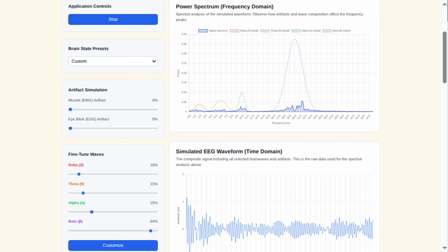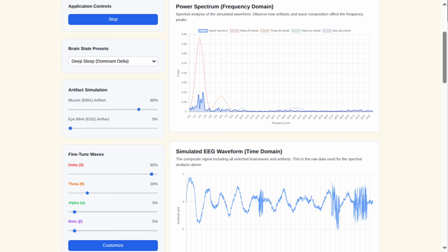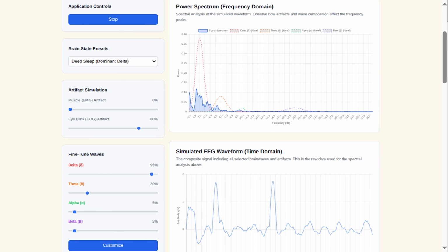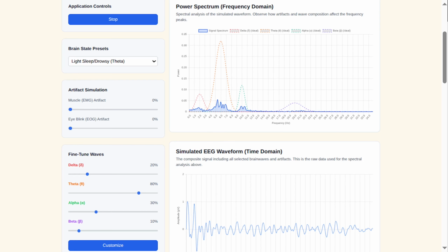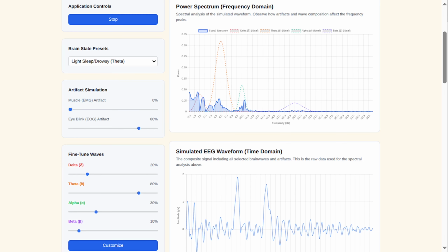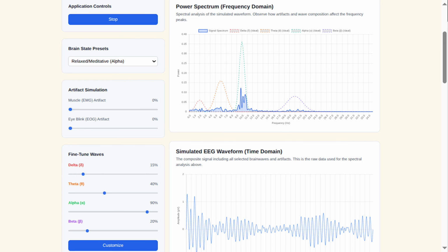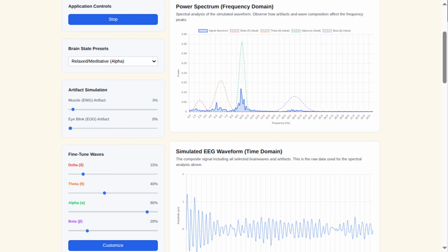Okay, and how about the position of the electrodes, the electrode placement? Electrode placement follows standard systems like the 10-20 system, ensuring consistent positioning over specific brain regions. Accurate placement improves the ability to capture relevant brain activity and minimizes signal contamination from non-target areas. Okay, and the depth? Electrodes sit on the scalp, so they primarily capture cortical or surface brain activity. To get signals from deeper brain structures, more advanced methods like intracranial electrodes or special imaging techniques are needed.